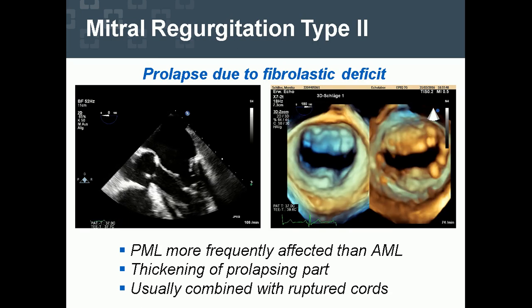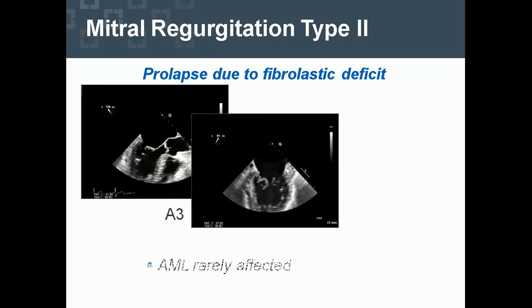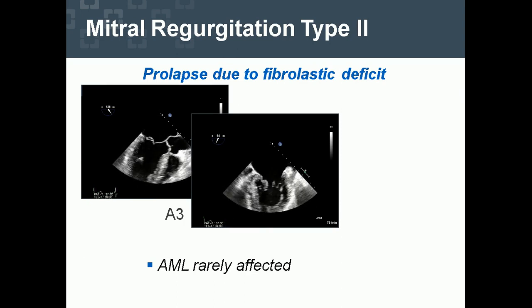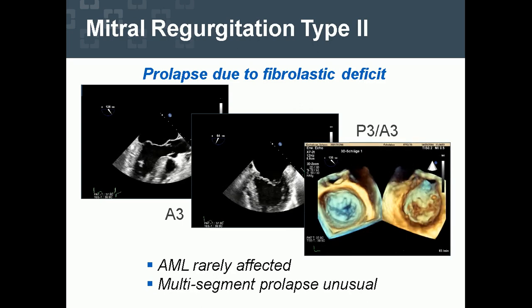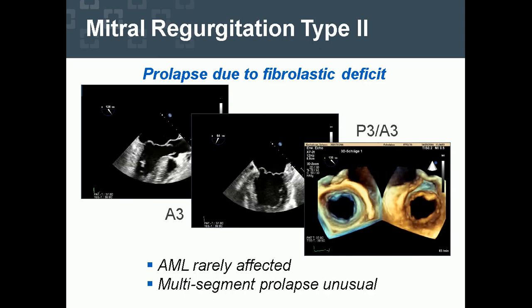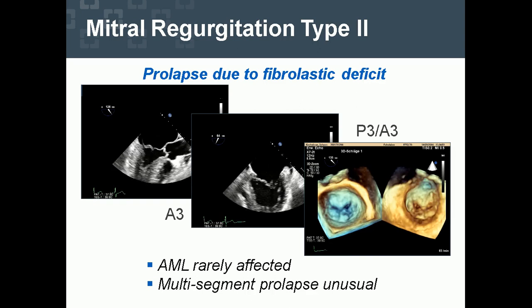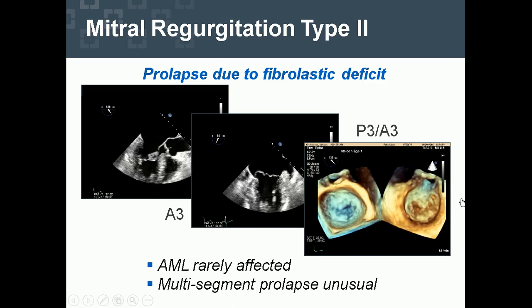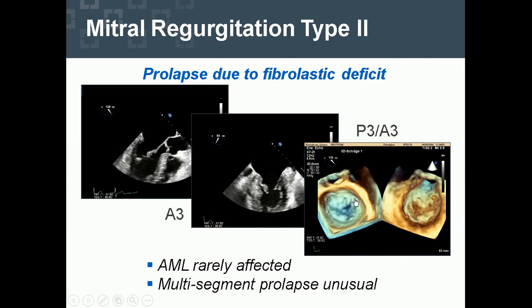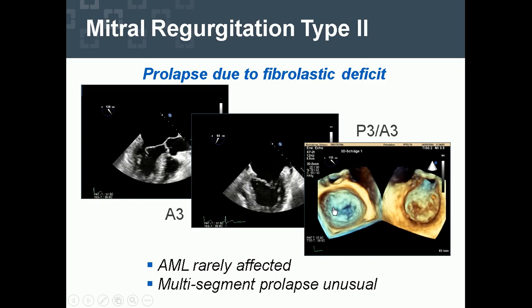Usually this is combined with ruptured cords. On 2D, the anterior mitral leaflet is rarely affected but can be, as seen here with an A3 prolapse. Sometimes it is also a multi-segmental prolapse, although this is not typical. Single-segment prolapse is typical for fibroelastic deficit, but sometimes two segments are involved — for example, A3 and P3.